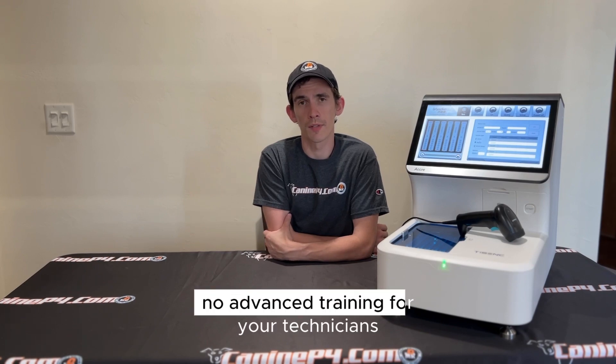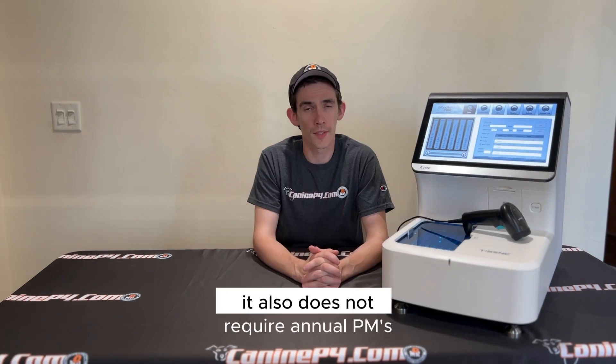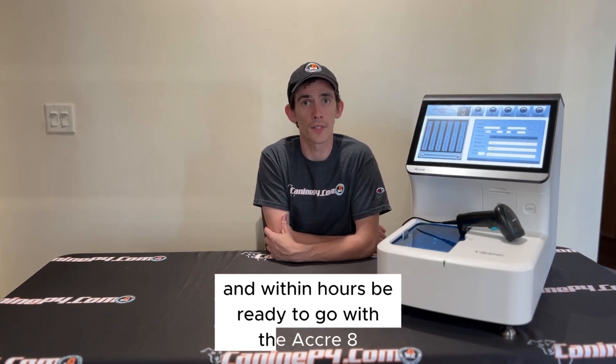No advanced training for your technicians on how to troubleshoot common everyday problems. The Accre 8 also does not require annual PMs — it's virtually maintenance free outside of manual calibrations. View the remote training online and within hours be ready to go.